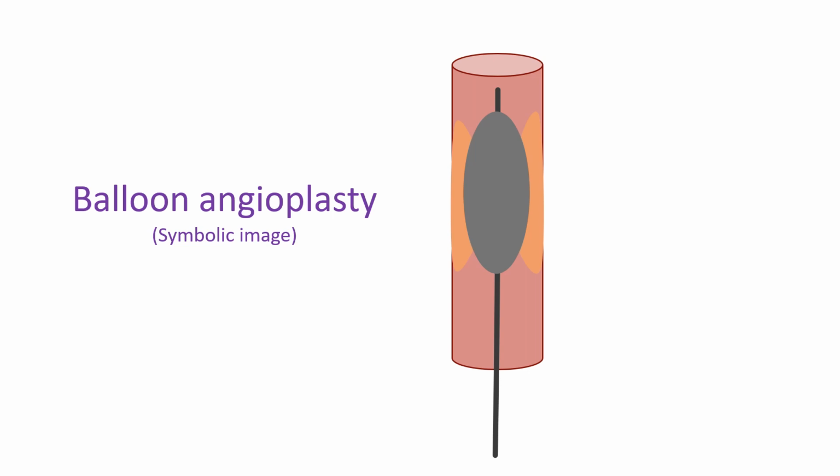Some complications have been reported with carbon dioxide angiography due to formation of vapor lock within the blood vessels. Bleeding at the blood vessel puncture site can occur in carbon dioxide angiography as in conventional angiography. This is prevented by giving good compression after removal of the injecting device.